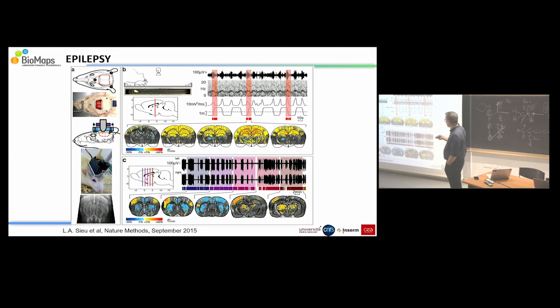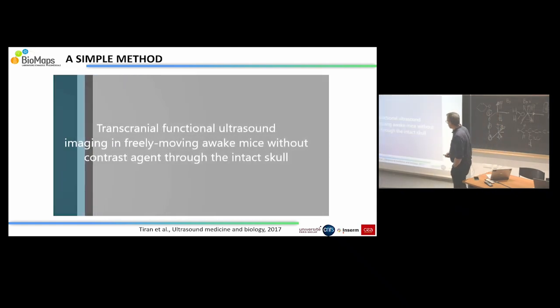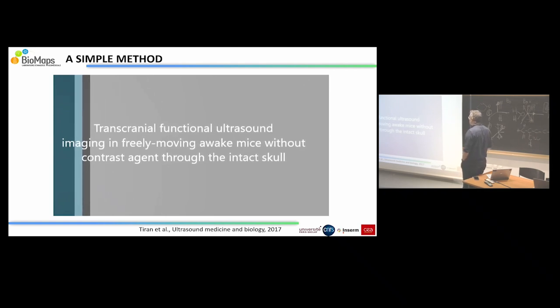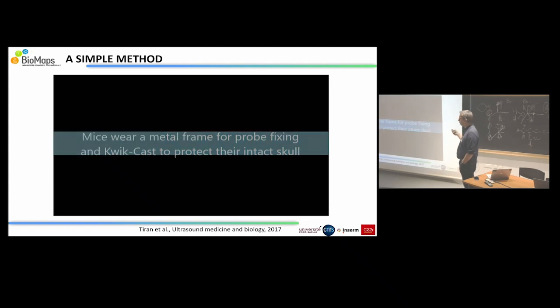Here it was one which has seizures, and we record the EEG, we record the B mode, and we study different places in the brain during this pathology. And now the technique is easier. I showed you with a rat. With a rat, we need to remove the skull.